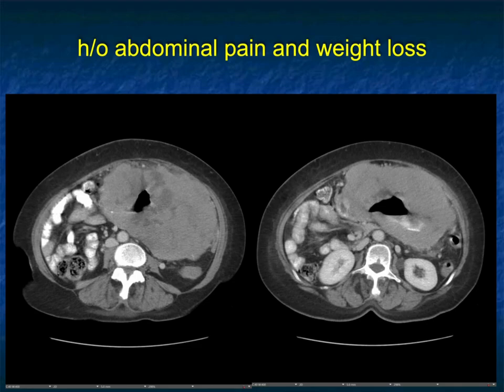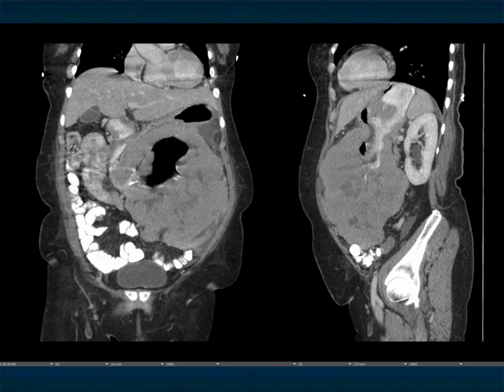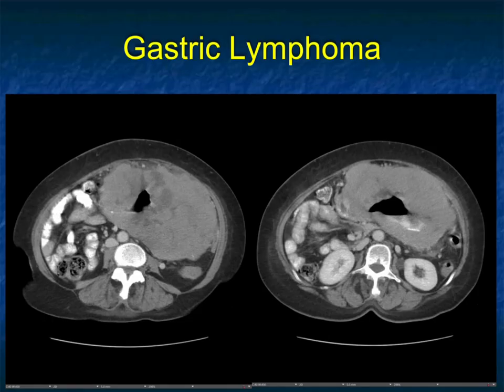Here's a classic case of a patient with abdominal pain — a very large, bulky tumor with diffuse infiltration. It doesn't have the look of a GIST tumor, which is usually eccentric, nor a classic adenocarcinoma, nor metastatic disease. When something looks this bulky, even with minimal adenopathy, this is a classic case of a large gastric B-cell lymphoma, nicely shown in the sagittal view. The tumor is so large you initially wonder if it could be arising from the small bowel pushing against the stomach, but the sagittal image best shows how the tumor really infiltrates the stomach wall.